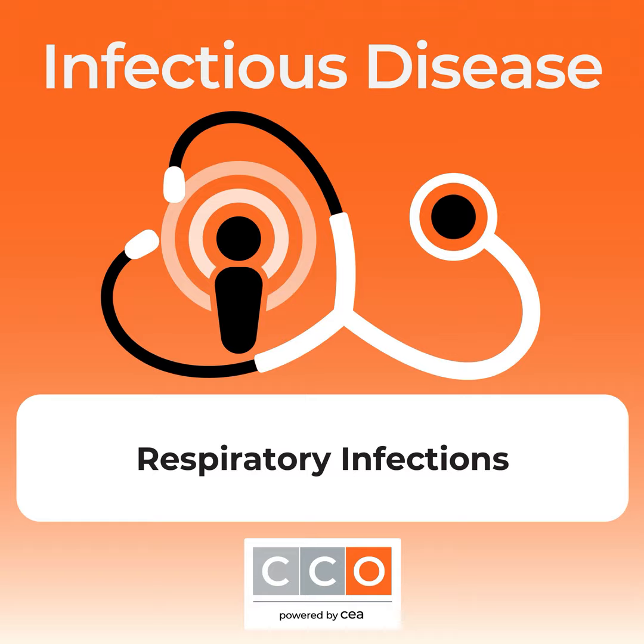So I told you before that the lower respiratory tract infection panel, the BioFire pneumonia panel, gives semi-quantitative results for most of the bacteria. And so this is the way they do it. They do it in bins. So the options are the organism not detected, 10 to the fourth copies per ml, 10 to the fifth, 10 to the sixth, or greater than or equal to 10 to the seventh. So these are semi-quantitative bins. And importantly, these do not necessarily correlate with colony forming units per ml. So you're probably used to in your BAL cultures, that's how you get those results, greater than 10,000 CFUs per ml, for example. This is copies of DNA per ml. That's important because it doesn't always necessarily correlate with CFUs per ml.